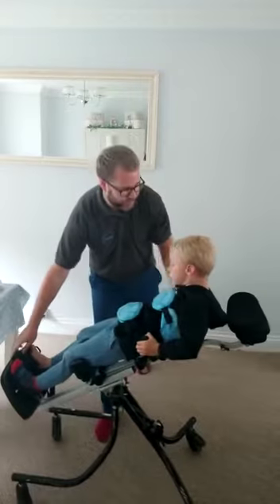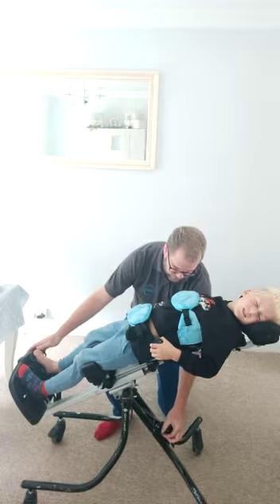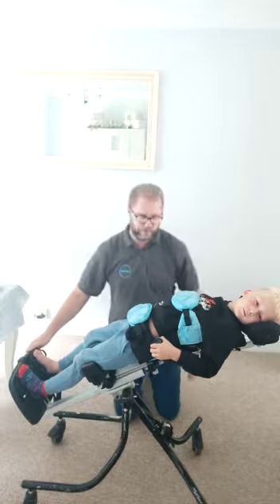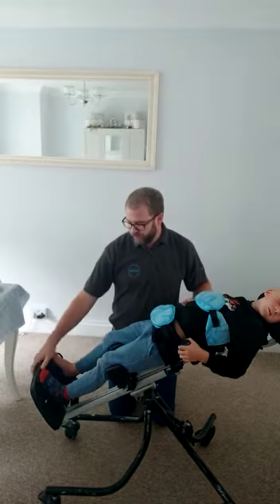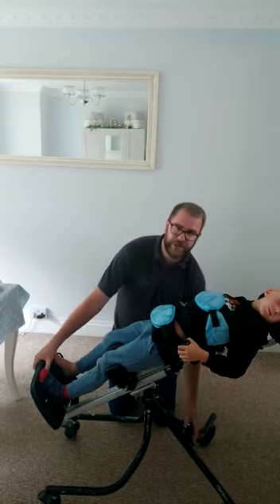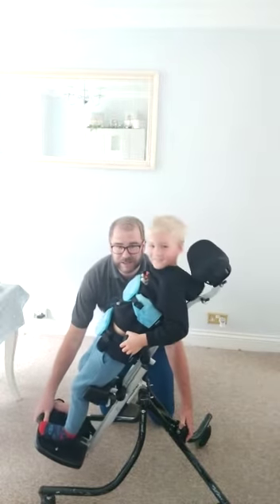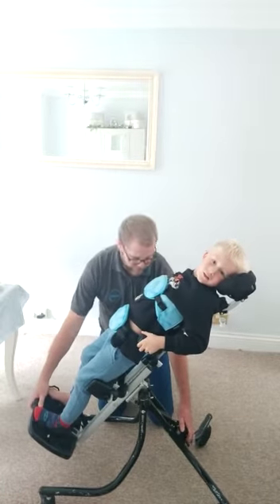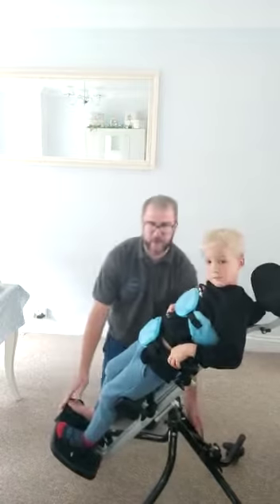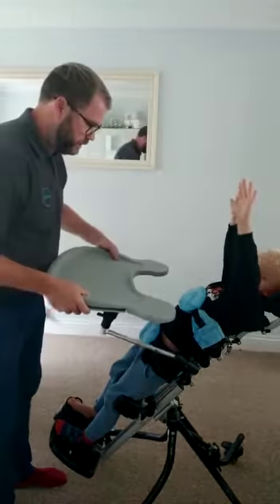When he's ready to go, there's a pull pin — a silver pin on here — that you'll have to pull out and twist. Then you've got the lever that you push down, but before you do that, always come to the side of the standing frame — maybe on your knees — hold the foot plate with one hand and push down the lever with the other. Then you just come up nice and slowly as far as you need to, from the advice you get from your therapist. If your child hasn't stood for a while, just come up nice and slow. Once you're about halfway, lock the pin.